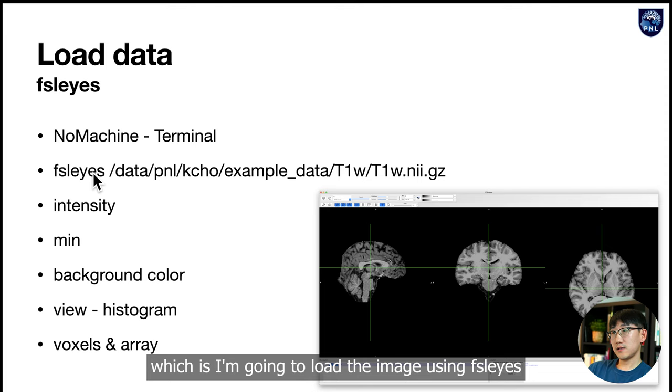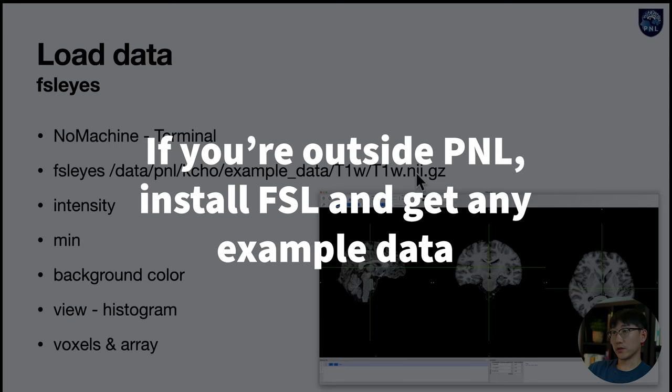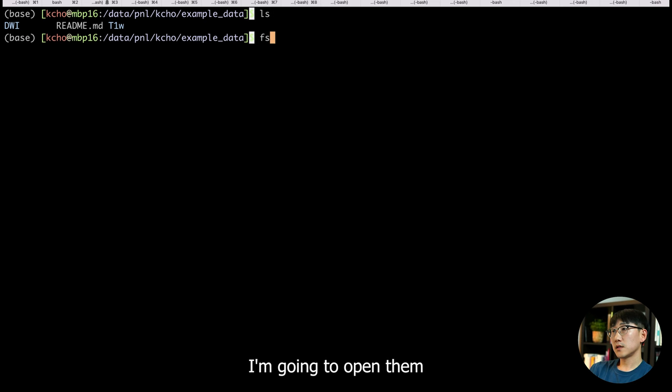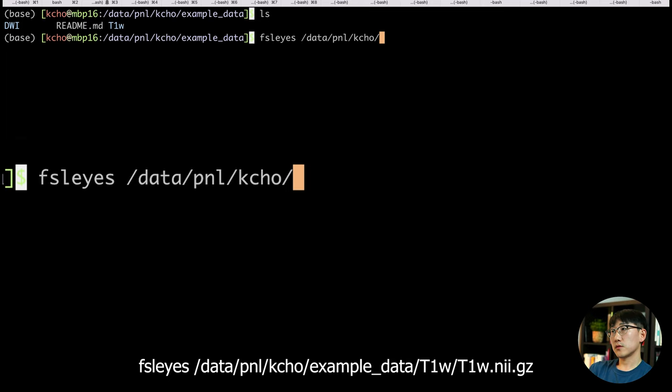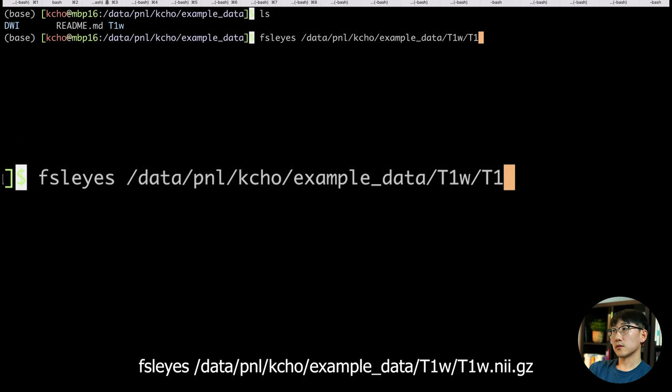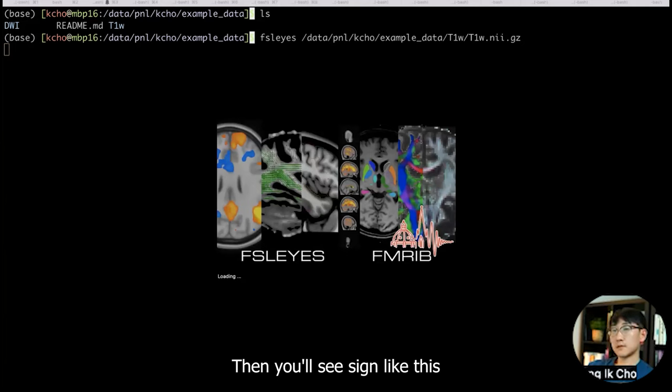I'm going to load the image using FSL eyes. The example data is in here. I'm going to open FSL eyes and data PNL kcho example data, and then T1 weighted. There will be a T1 weighted image. I'm going to open them like this and you'll see a sign like this.